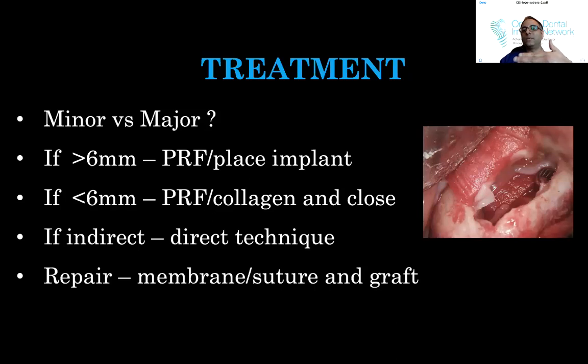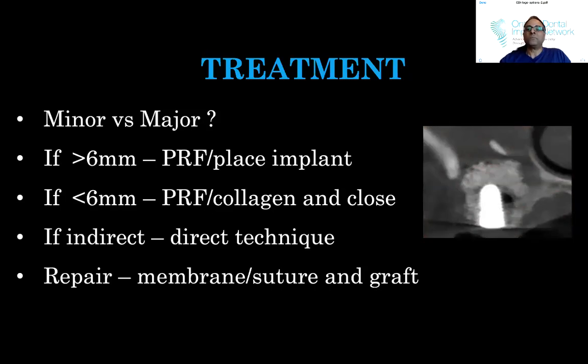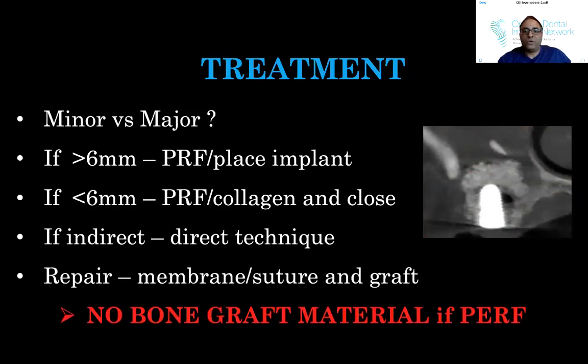And then what happens is I'll go ahead and graft the bone, and then I'll close that site back up. Okay, and you can see that's the post-op suture case. We haven't seen this patient since. This case was done about 3 months ago. So again, if you feel comfortable, but remember, do not place bone into the area.